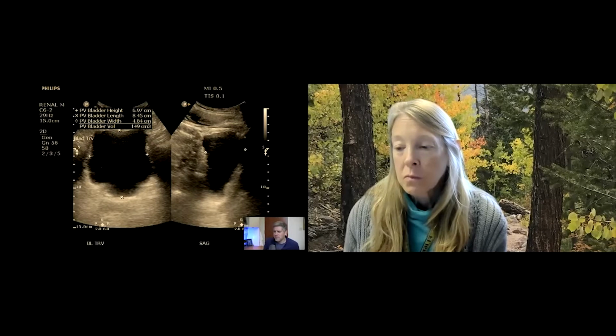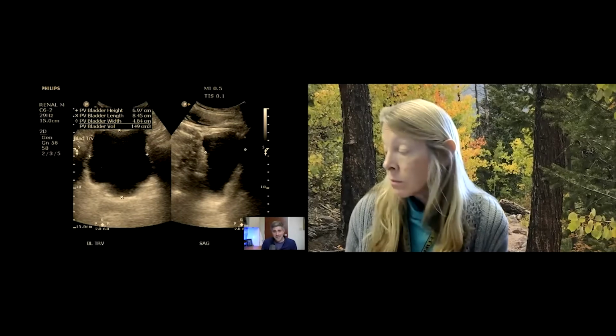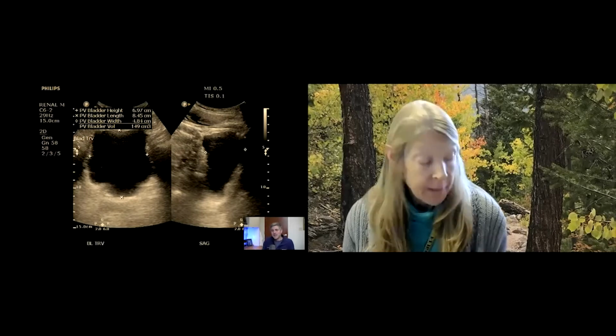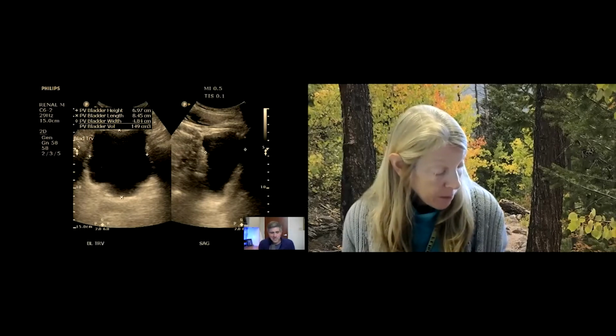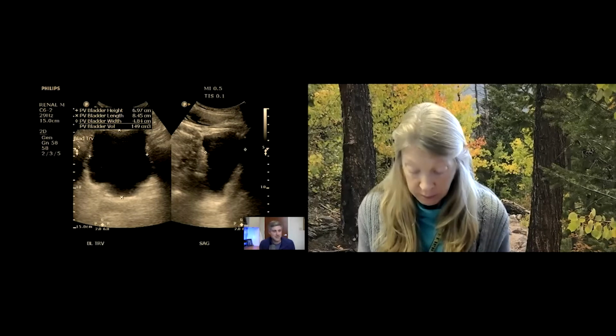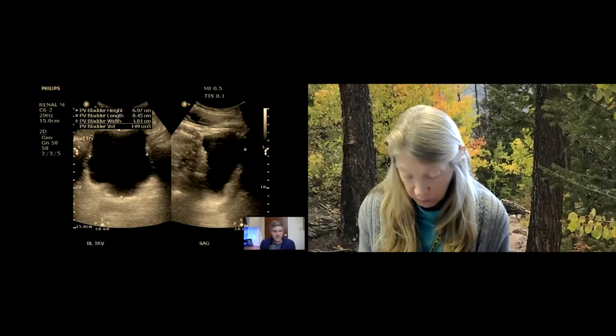And I've often been curious, never actually done this study officially, to say, okay, at what point do you feel like you got the urge to go? Like, you say, okay, I feel the urge, I'm going to scan and see how many cc's are in there. And my general suspicion is that number is going to be slightly variable between person and person. I think it might be an interesting study to do, at least for academic understanding.